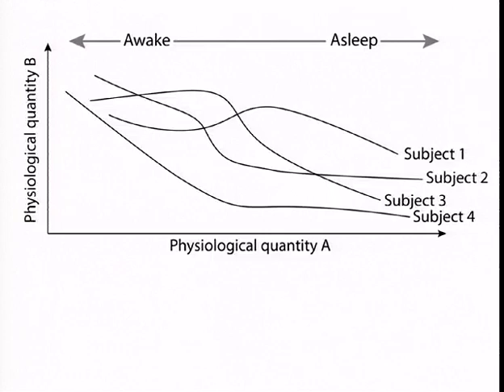So for example, on one side here we have sleep, and on the other side wake. And then the other thing that we want from these quantities is we want to be able to relate them to dynamical activity that we could measure, for example, with EEG.